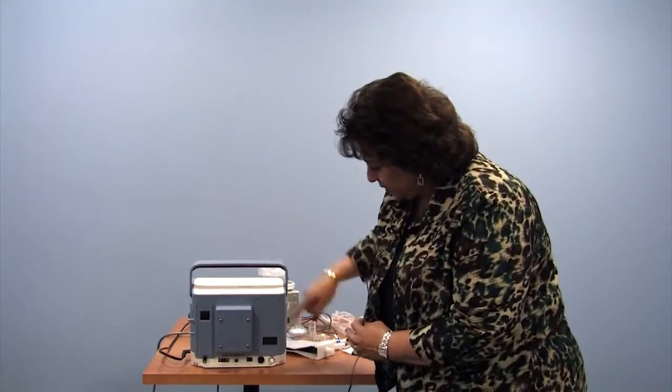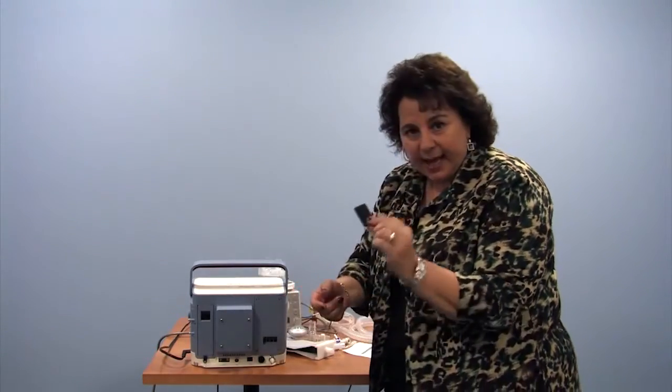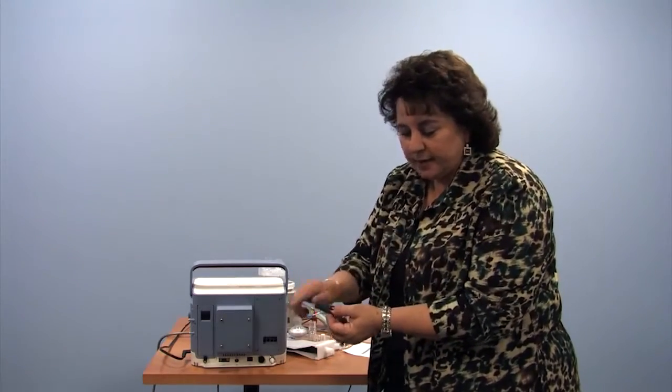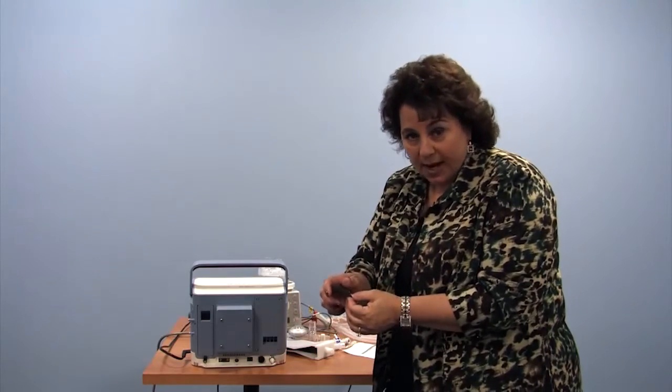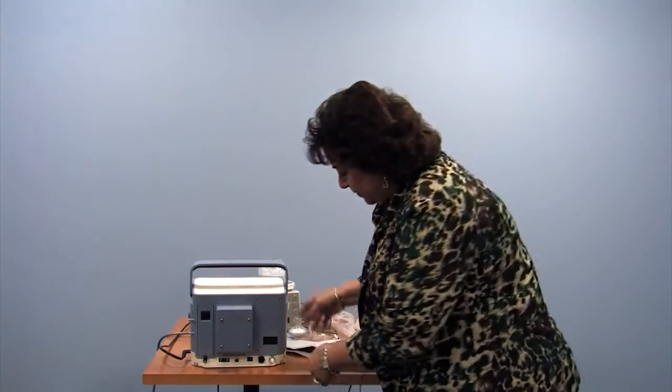On the rear of the machine, we have a simple inlet filter, black, that will get dusty and need to be cleaned. If you wash it with water, please dry it before you put it back onto the machine. The company will provide you with additional filters.